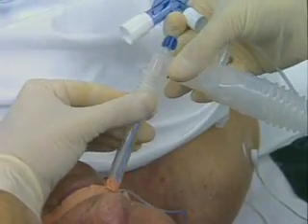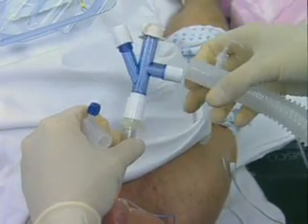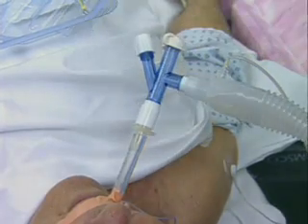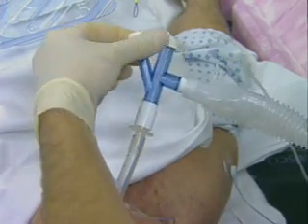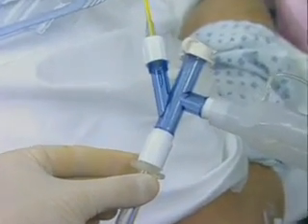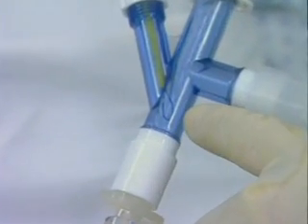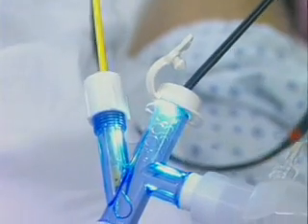Assembly of the device is straightforward. With a conventional endotracheal tube correctly placed above the carina, the ART multiport airway adapter is attached to the tube. It then connects to a standard anesthesia circuit and the patient is ventilated with 100% oxygen. The ART endobronchial blocker uses a monofilament guide loop assembly which fits through the lumen of the endobronchial blocker and exits from the blocker's distal end to form a small adjustable monofilament loop.